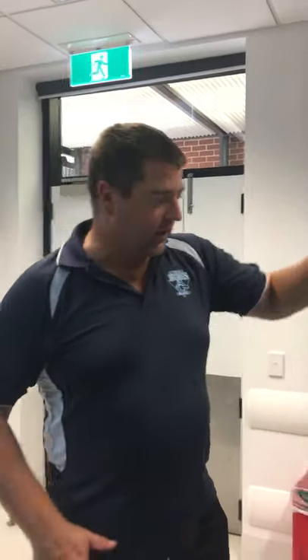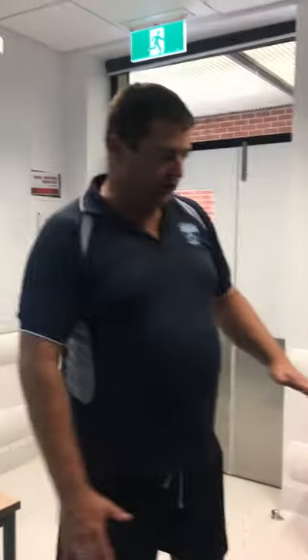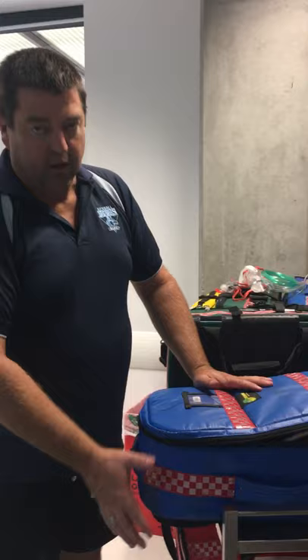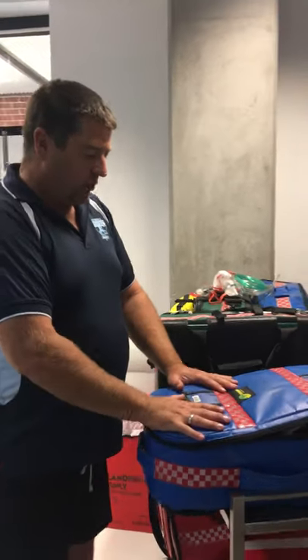Thanks for joining me. I just wanted to show you a couple of things. Firstly, this is what we use as an ambulance trolley on campus, and this kit is what we're going to talk about today, which is your OxyVigor.